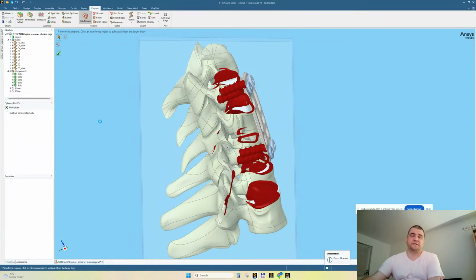logical problems. For example, if it decides to cut the fusion cage, it's not logical, because in surgery we cut the bone. We don't cut the titanium, the metallic implant, of course. This is what I was talking about. For example, I'm curious which one will cut, which one will be cut, all right? Of course, the vertebrae is bigger, is larger than the implant. But will the software understand?